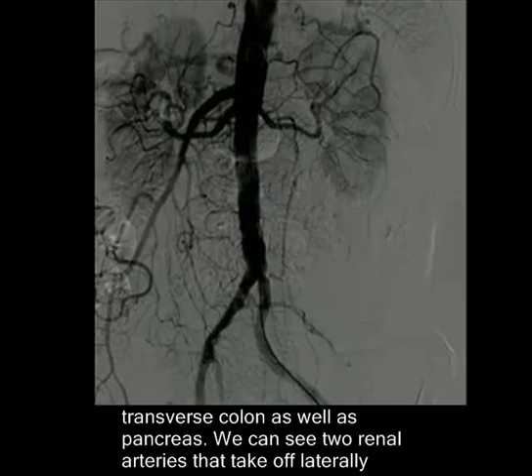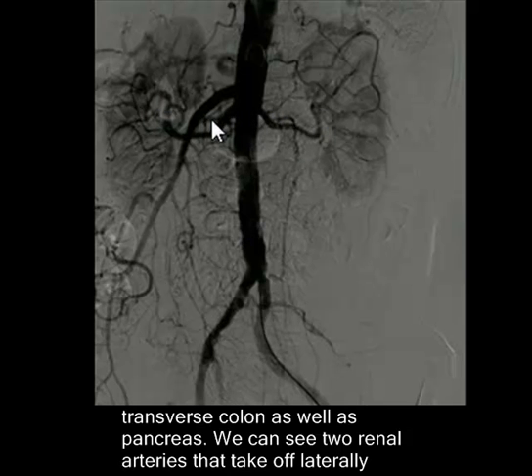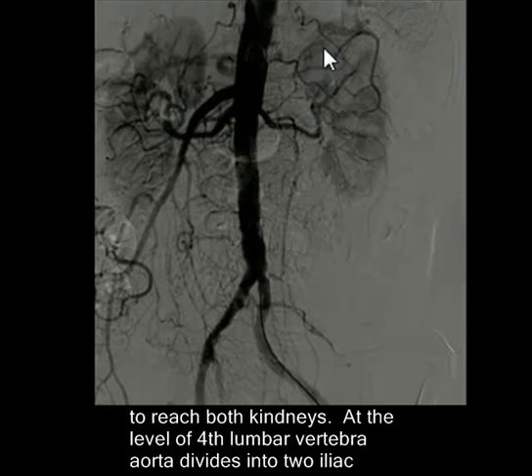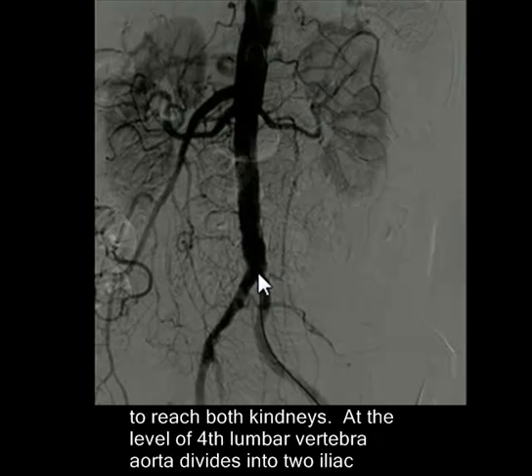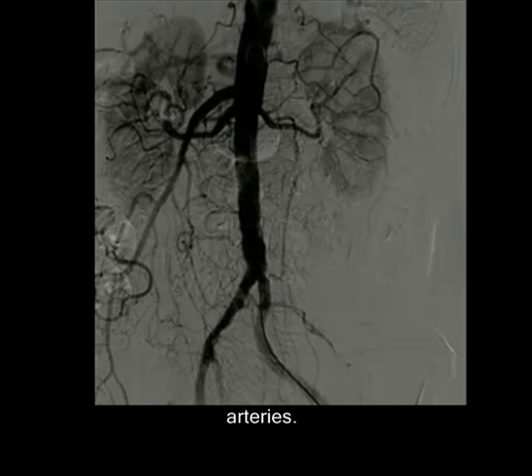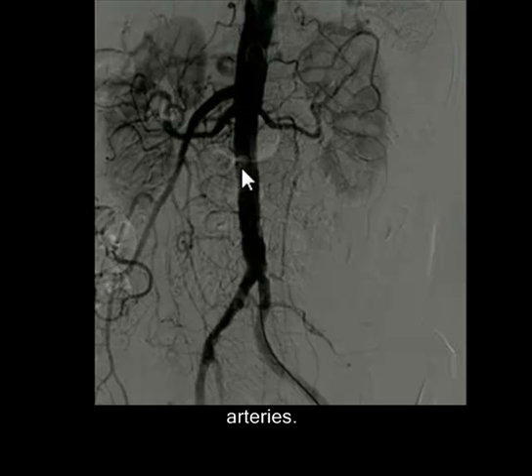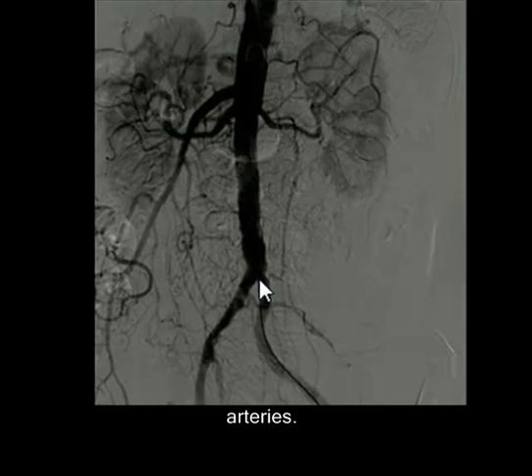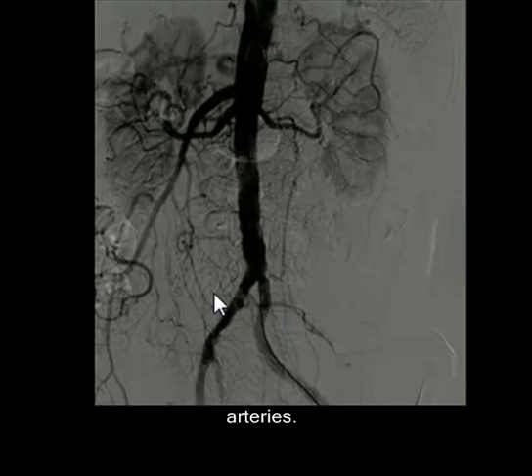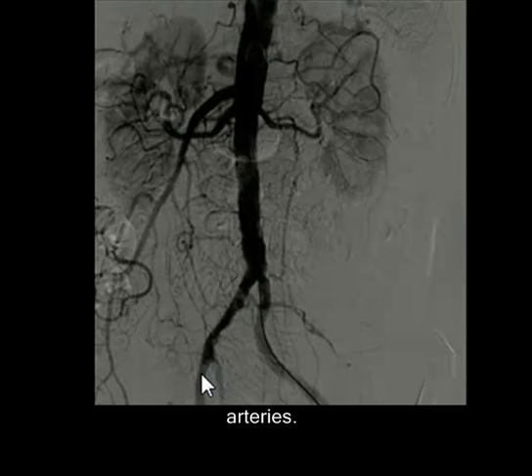You can also see two renal arteries coming out of the abdominal aorta that supply oxygenated blood to the kidneys. The aorta divides into two iliac branches at the level of the fourth lumbar vertebra. So it is one big vessel giving off small branches, and it divides into two at L4 — the two common iliac arteries — with an internal iliac artery and an external iliac artery on each side.